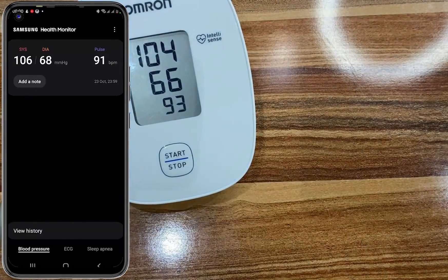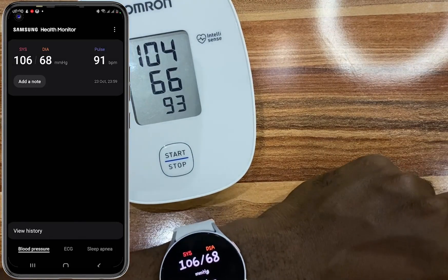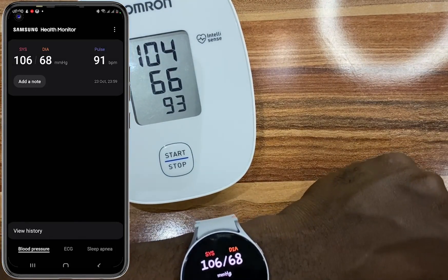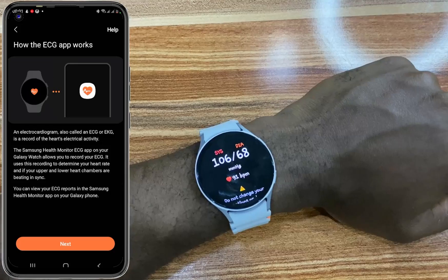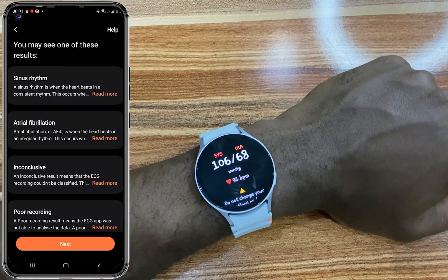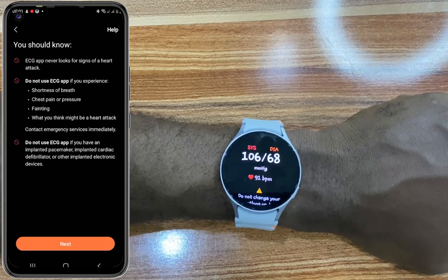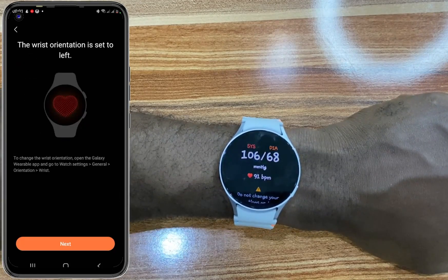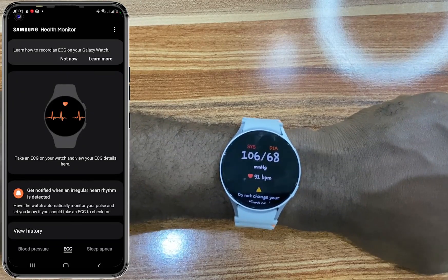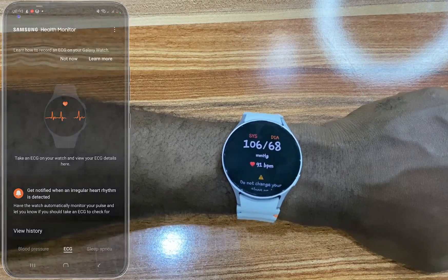Next, we are going to set up ECG. Go ahead and tap on ECG. As you can see on SHM on the phone, tap on ECG and tap on Get Started. Now go ahead and tap on Next, read through all the warnings, and tap on Next to proceed. Tap on Next, read through that, tap on Next, and then tap on Done. That is how you set up ECG on the watch.